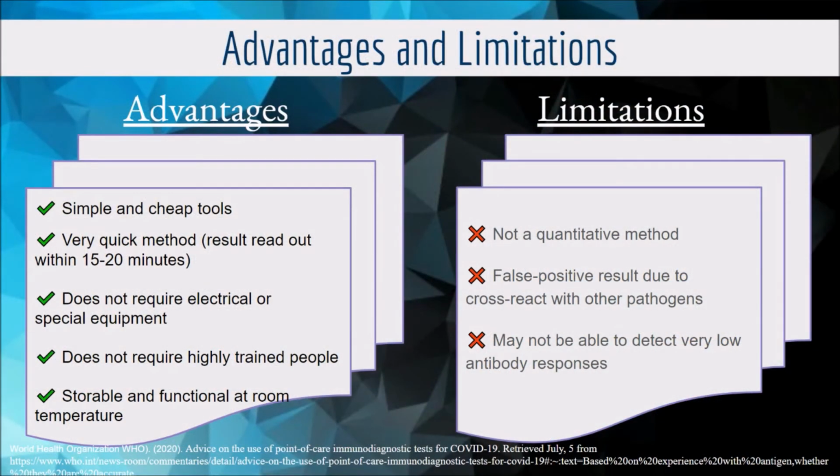For the advantages and limitations of rapid diagnostic tests, there are some advantages of RDT, which is simple and cheap, where the usage is by just putting the sample in the specimen well provided on the device, and the result can be read out after 15 to 20 minutes, which is quite fast.